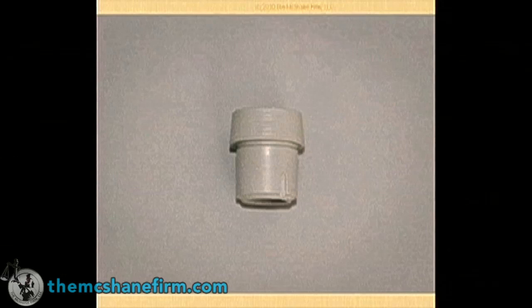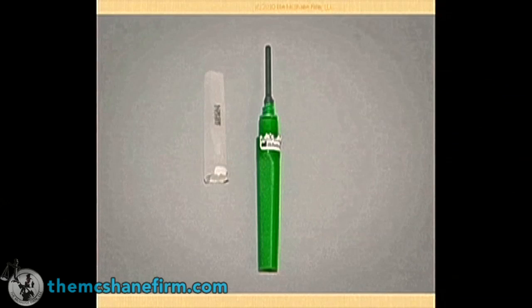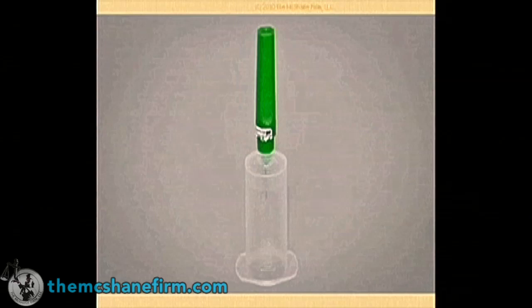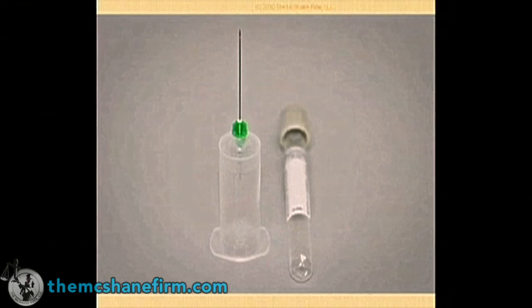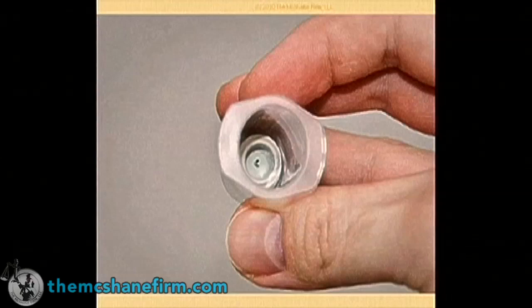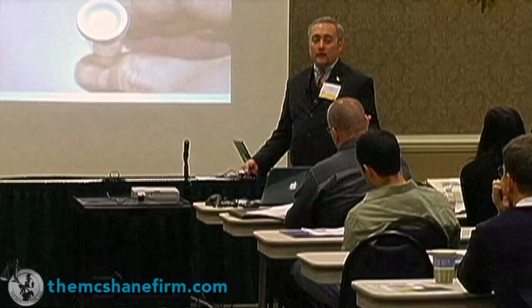The hemoguard. This is the septum. One of the most important things that I've been doing lately is going to the lab to examine the septum, because I have no life and this is what I love doing. But the purpose behind it is to take a look at the puncture that's there. It should only be punctured one time, as we'll see here, and this is the transfer tube. As we take a look at it, that's it collected and put together. And the most important thing to drive away from this in a slide here is how it's all assembled. So that's it assembled when it goes into someone's arm. That's what it should look like. But as you can see here, there's only one prick that goes on through the septum that's there. If you see multiple ones, two things happen. Either, you know, they did it, well, no matter what, they did it wrong. So you're looking for multiple entries that are there.